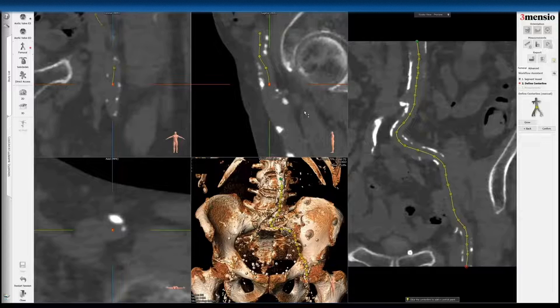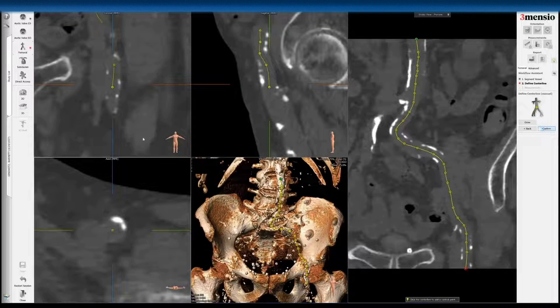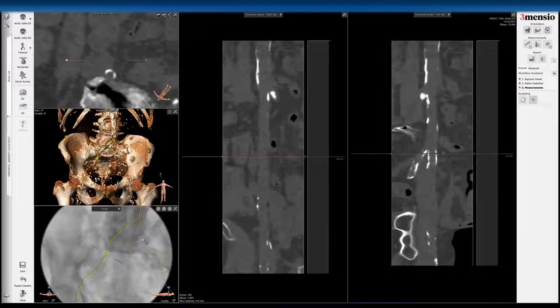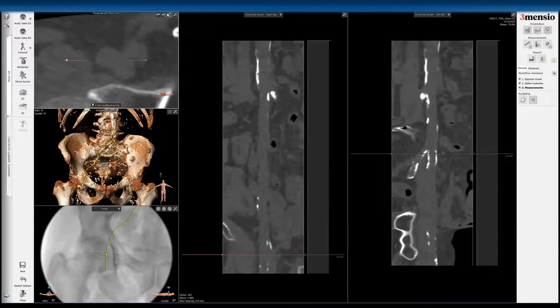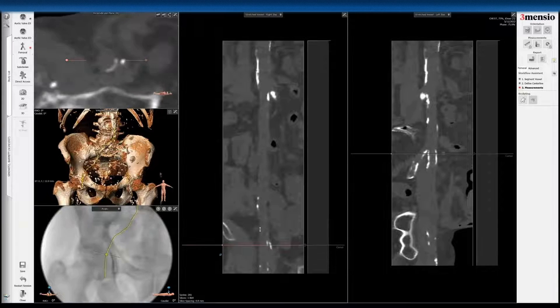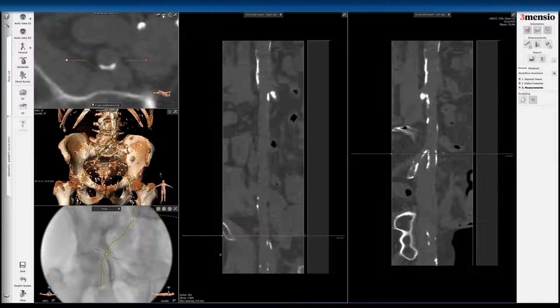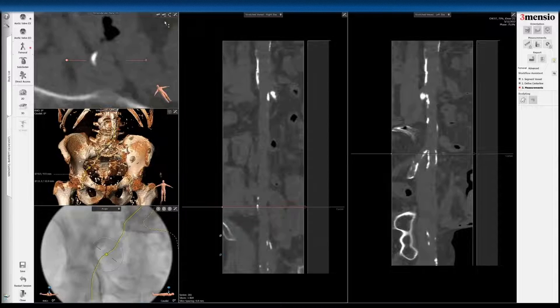So once you finish here, you can see that's pretty much where the bifurcation starts with the SFA and profunda. You can then click confirm. I'm going to the bottom left, click angio view, and go down to the femoral head here. You're looking for a clean spot to puncture — you can actually see the outline of this vessel quite well. I'm going to mark this as the right femoral artery, and go up there. Because you see this little calcium there at the external and common femoral junction, I'm going to mark this as well. Because it's non-contrast, you won't be able to see that very well, so you want to make sure the operator is aware of this calcification.